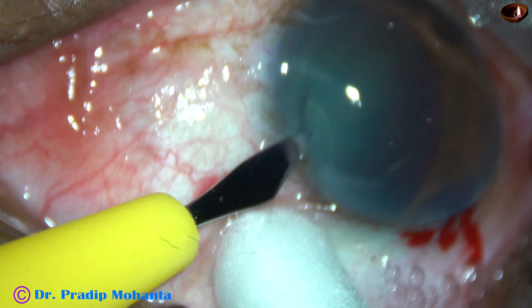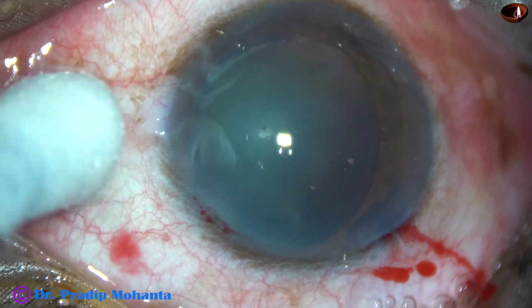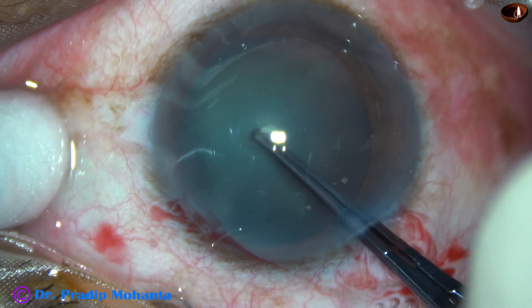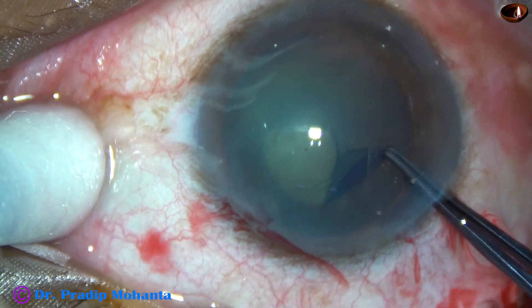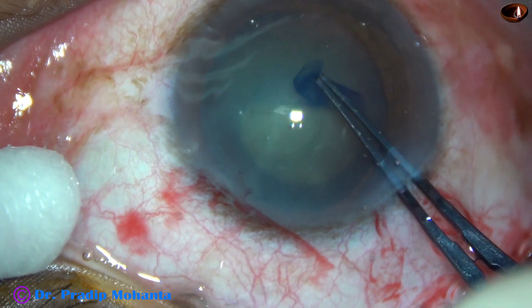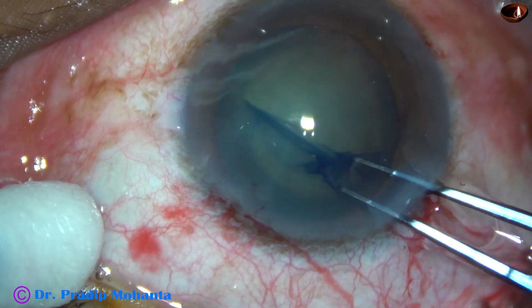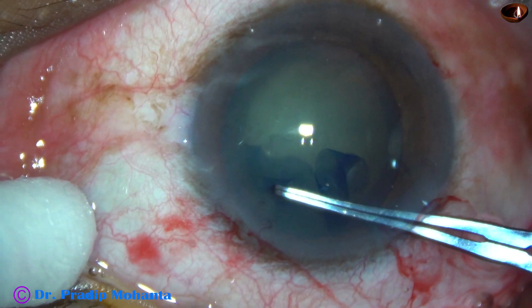The left side port is done now, and capsulorhexis is done with the help of these utrata forceps. The anterior capsule is torn, a capsular tag is obtained, and the tag is guided anticlockwise all around, and an adequate-sized rhexis is achieved.